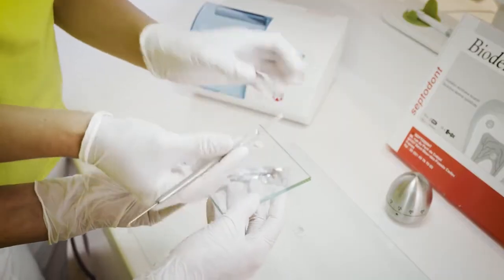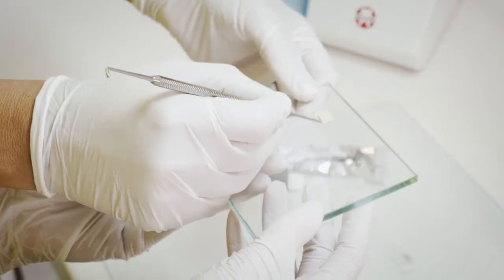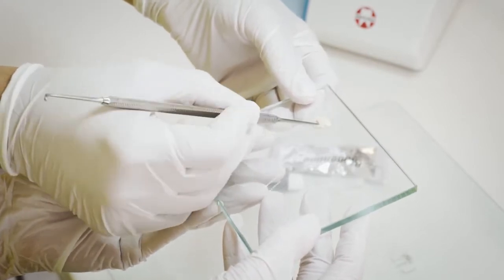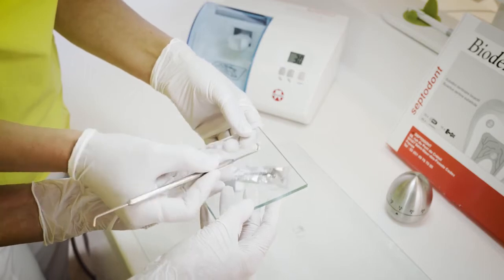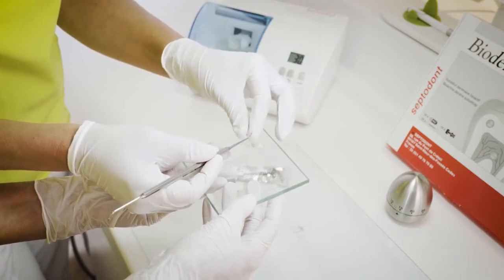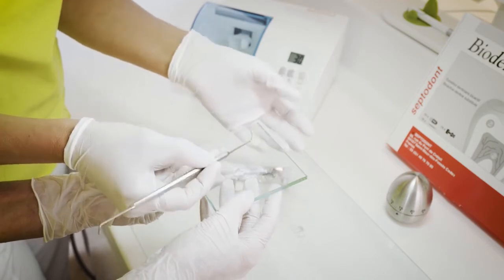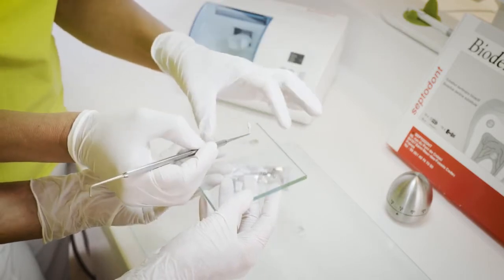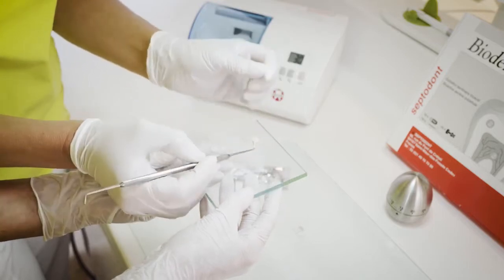At this point I'd be using my favourite instrument for this, which is a PF-49 — a plastic. Initially I'm just wanting to check the consistency, making sure I'm happy with it. That's really nice and creamy — pretty ideal as far as I'm concerned. I separate a small amount out and pick it up, then I've started rolling it because that gives a nice smooth edge. That's how I like to place it in the cavity. We've got a little bit of flow to it but it's not dripping — it's got good firm consistency, so for me that's ready to go.